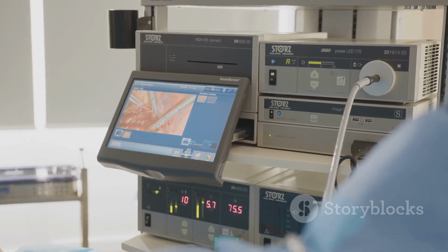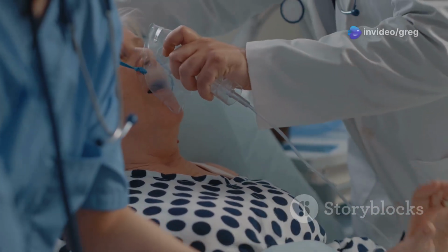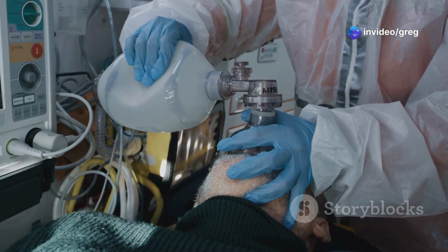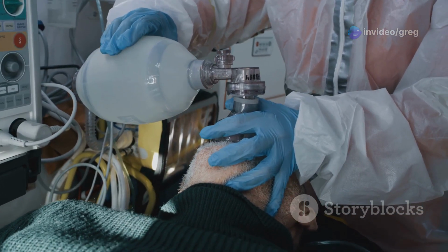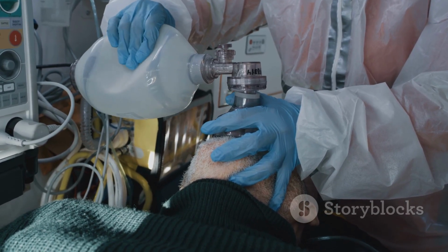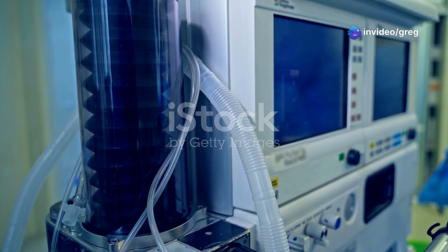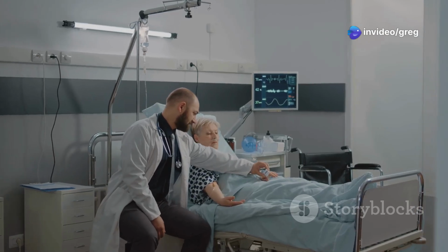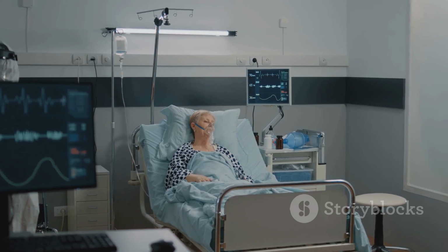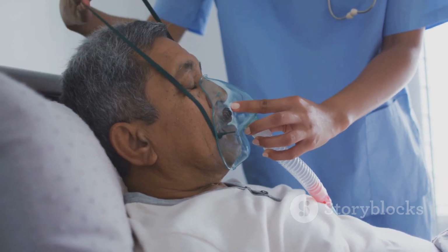The settings on a mechanical ventilator must be carefully chosen to provide adequate ventilation while minimizing the risk of VILI. Tidal volume, respiratory rate, and inspiratory flow are crucial settings that influence lung pressures and the risk of lung injury. High tidal volumes, as mentioned earlier, can cause volutrauma. Studies have shown that using lower tidal volumes, typically 6 milliliters per kilogram of predicted body weight, can significantly reduce VILI and improve outcomes in ARDS patients. This approach is called lung protective ventilation.